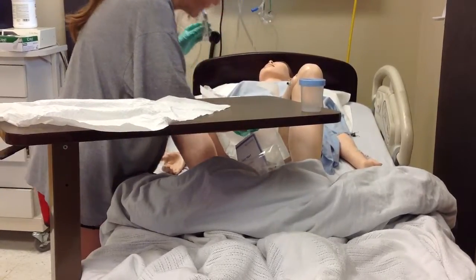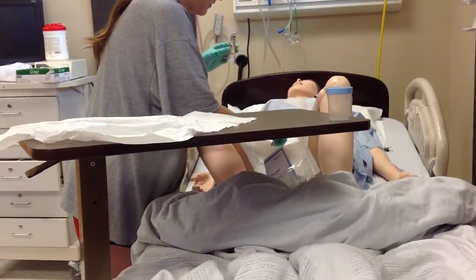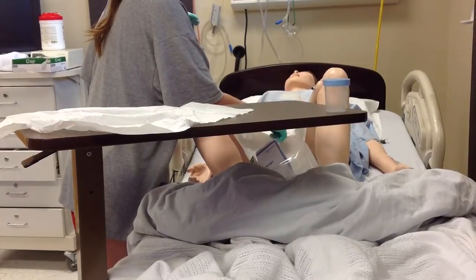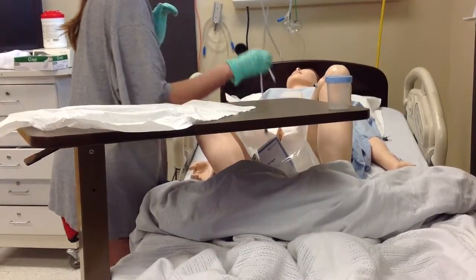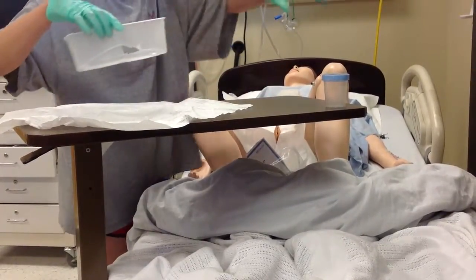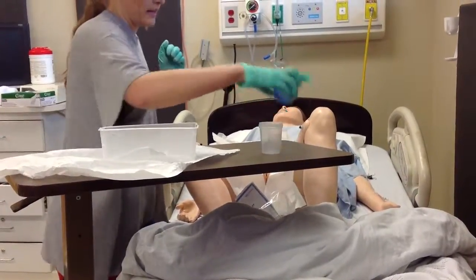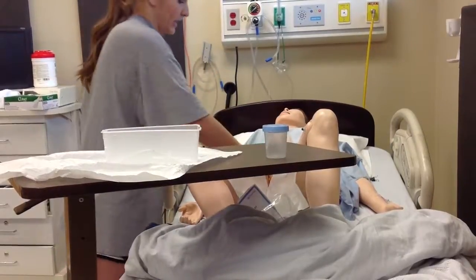Now I just want you to bear down like you're peeing. You might feel a little bit of pressure when we're inserting. The urine is flowing so we're about done — just a little while now. Now I'm just going to take it out. I'll put the cath in the trash and pour the specimen into the container — I should have probably had it open before. I'll label it with the patient info.